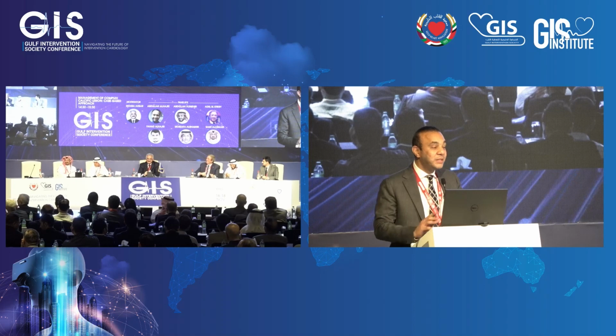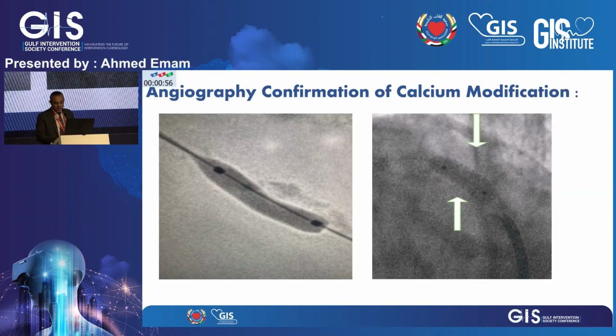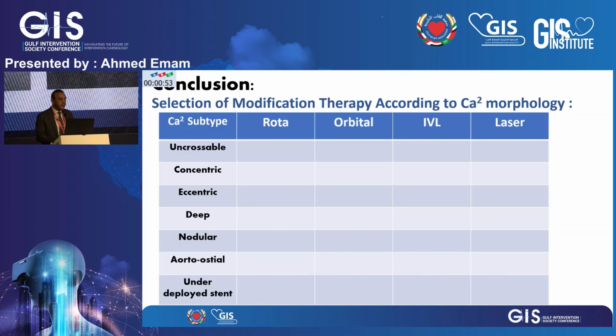So in this time, don't stent. But on the other side, if your wire is in the middle of the balloon, you can go ahead with stenting this time.